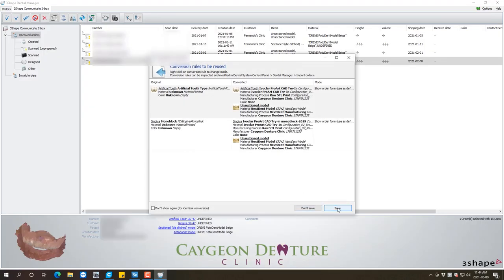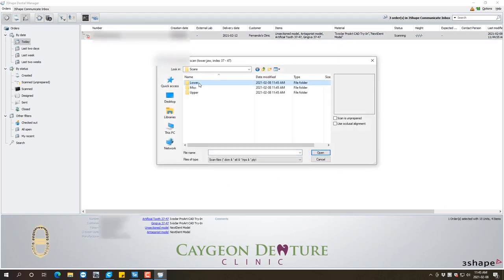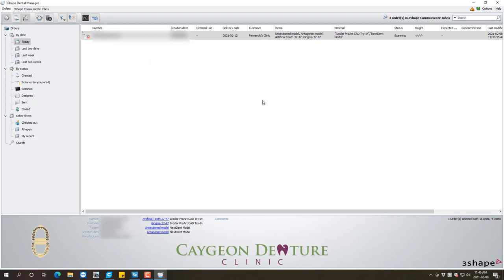Because I changed the work order that I created with my Trios software, once I create a new order in the Dental System, it does ask me to rescan all the lower and upper scans, including the bite. So as you can see, it is easy to do this.